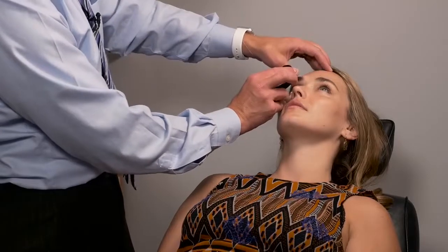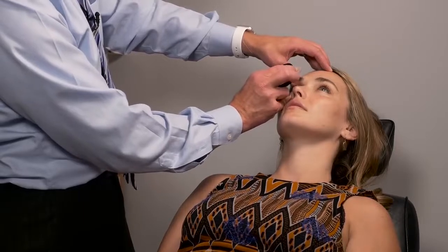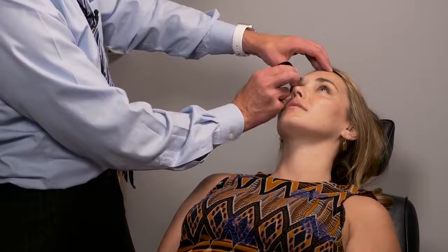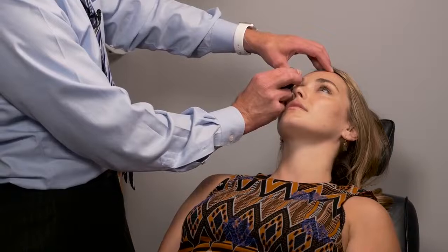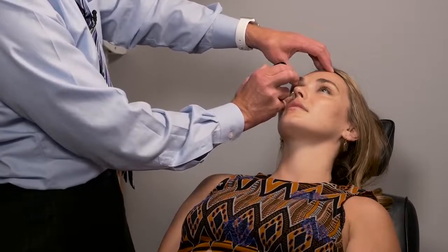I see the orange reflex. I pull backwards. One of the little subtleties of this, you'll learn to be fluid with your fingers, because as you pull back, because it's a round surface, you're going to have to turn it a little bit. That's okay. So you'll pull and turn, and you'll pick up the subtlety of that. So forward, I see the orange reflex. I pull back with my fingers. It's turning clockwise just a little bit.